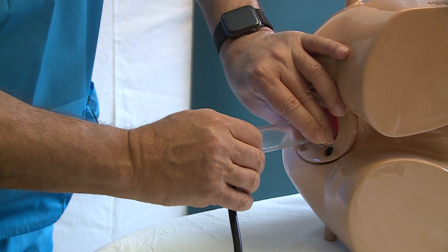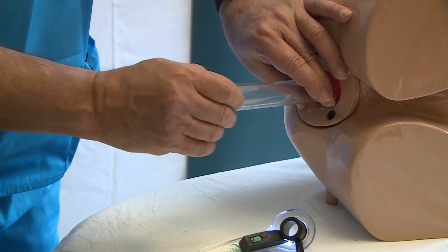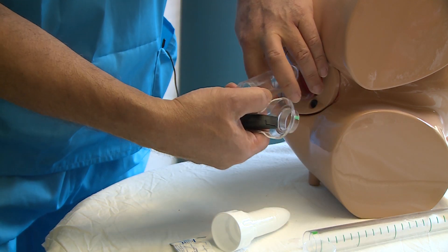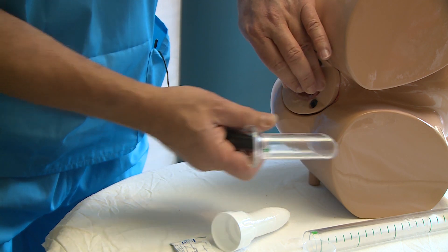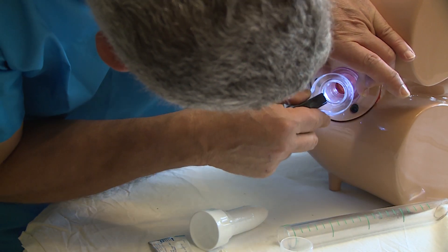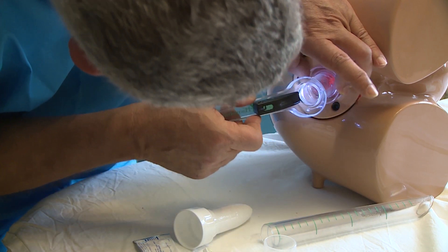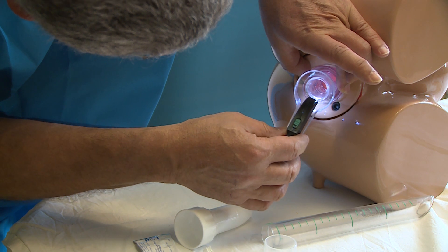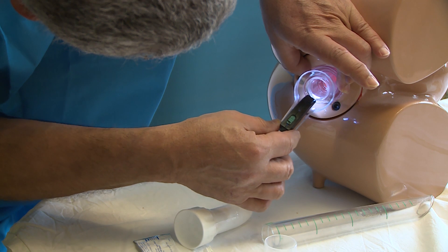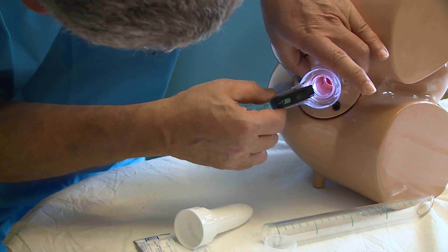When the sigmoidoscopy is finished, we remove the handle and the tube. We then take the handle and attach it to the proctoscope. With the light on, we introduce it through the sleeve — again, the patient will not feel it. There is a simple locking mechanism between the sleeve and the body of the proctoscope, allowing the proctoscope body to pass all the way through and then lock easily in place.